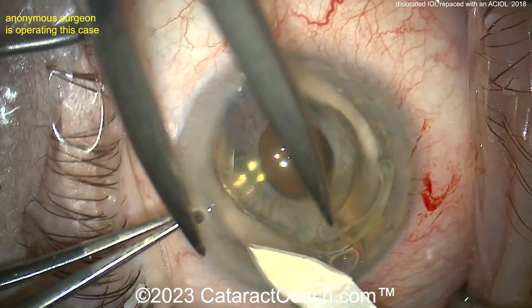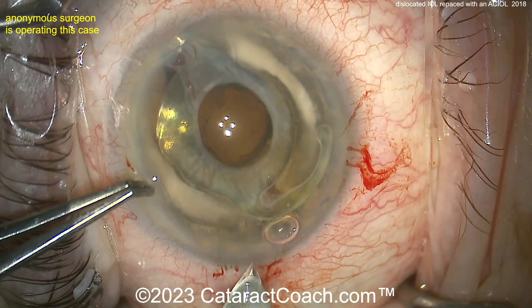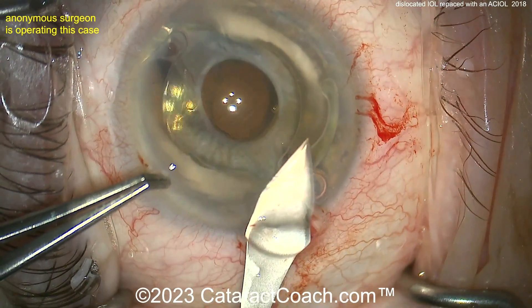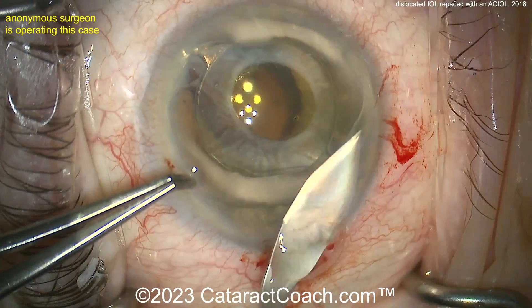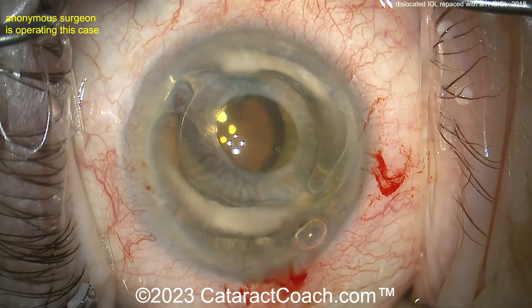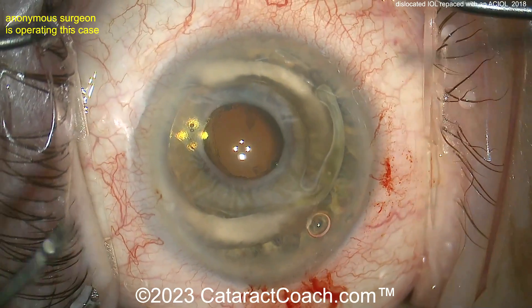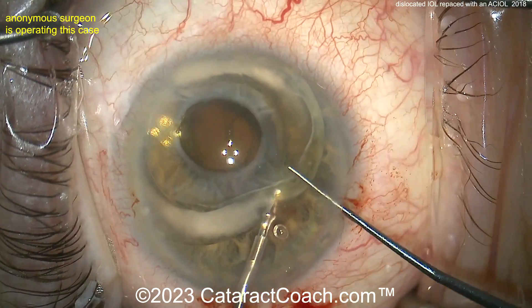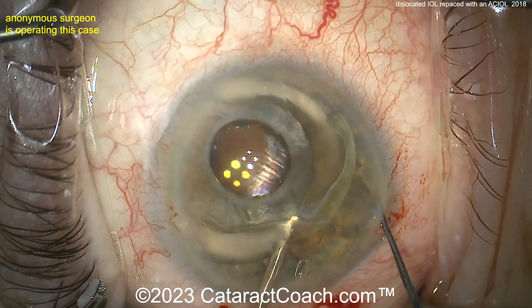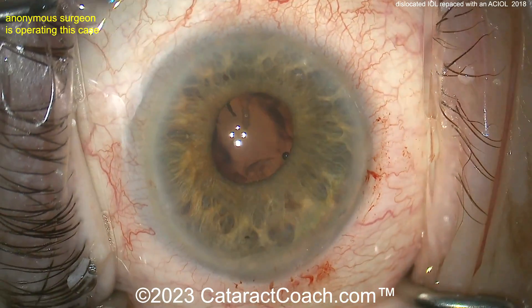I would not enlarge that incision — I don't think it's a good idea to make a six-plus millimeter wide corneal incision. I would have preferred to do a scleral tunnel in this case, because this is a large incision. You're going to need the large incision anyway to put the AC lens in, but I always taught my residents to use a scleral tunnel to implant any kind of non-foldable AC lens.